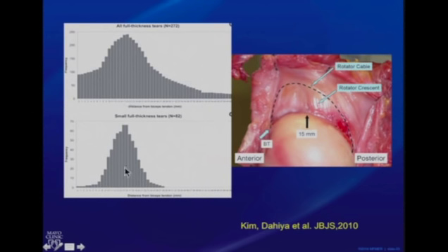When we looked at small full thickness tears, we again saw the predominant location to be around 13 to 17 millimeters from the biceps tendon. This led us to believe that the origin of the tears must be taking place at least 12 to 13 millimeters posterior to the biceps tendon, and then the tear over a period of time progresses anteriorly and posteriorly as it grows within the rotator cuff crescent.